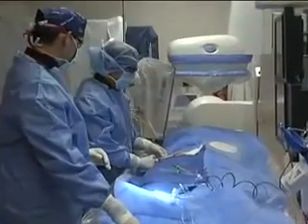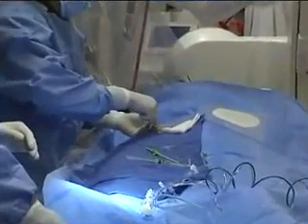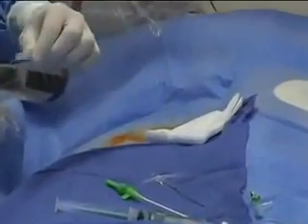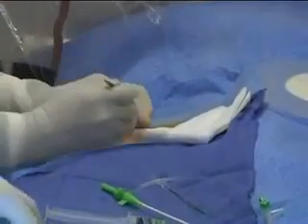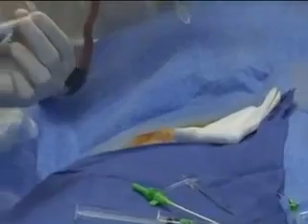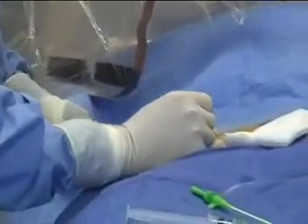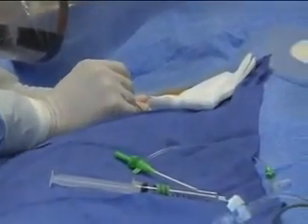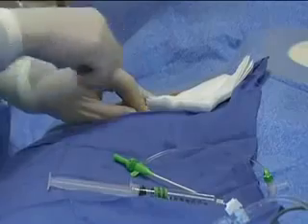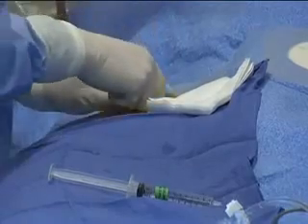We are going to access the coronary arteries via the right femoral artery. We'll first numb up over the vessel, and then we put a sheath into the femoral artery in order to pass the catheters.